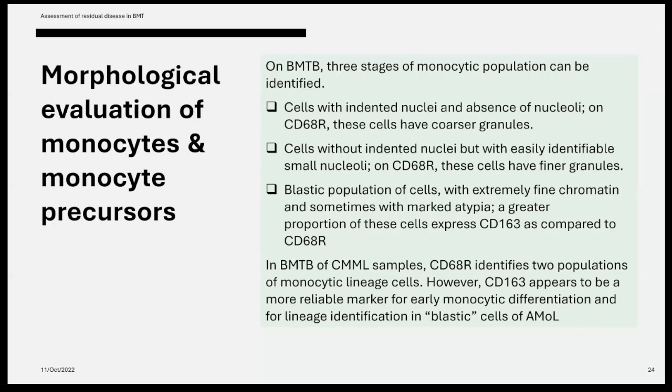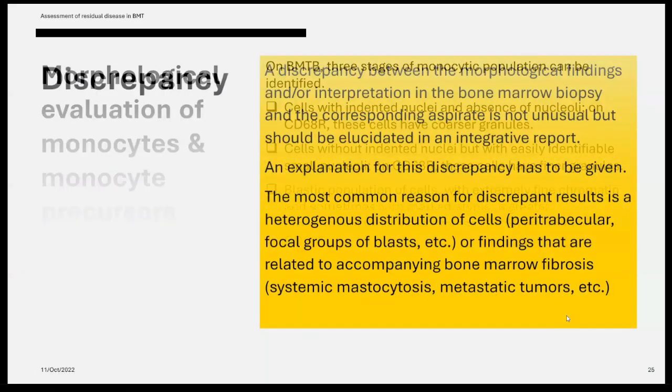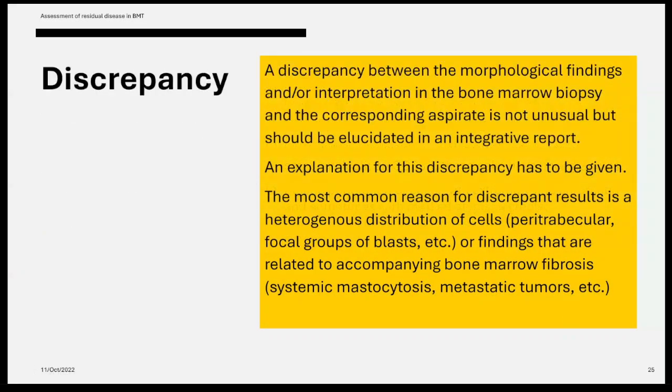We are highlighting the importance of this. So this is from an article, regarding CD163. A little bit on the discrepancy: the discrepancy between the morphological findings or interpretation of marrow biopsy and the corresponding aspirate is not unusual, but should be elucidated in an integrative report. An explanation for this discrepancy has to be given.